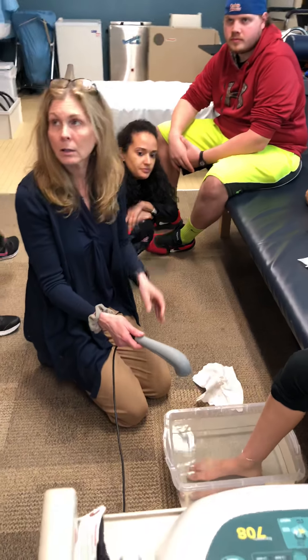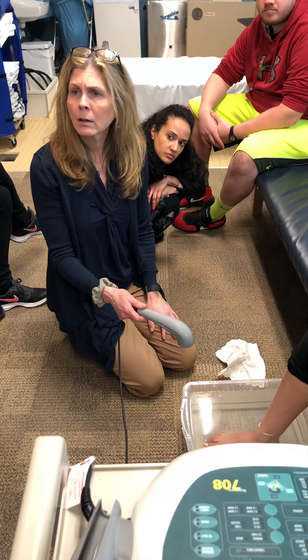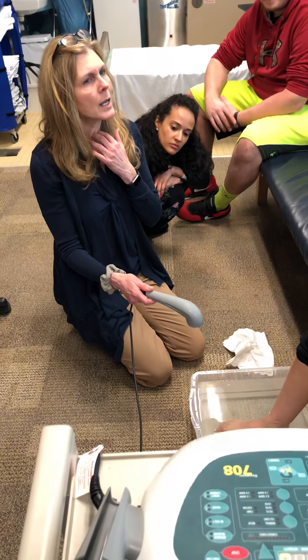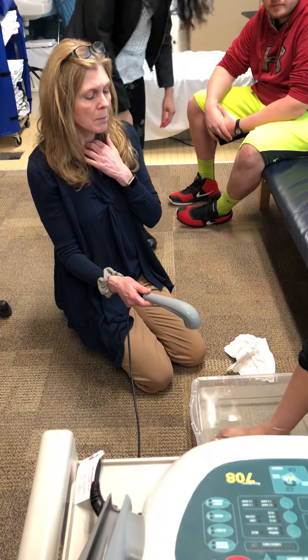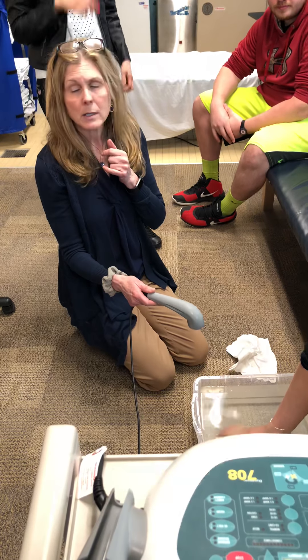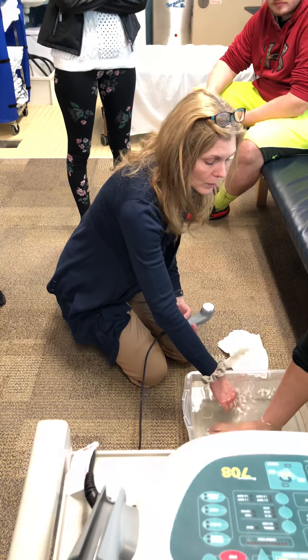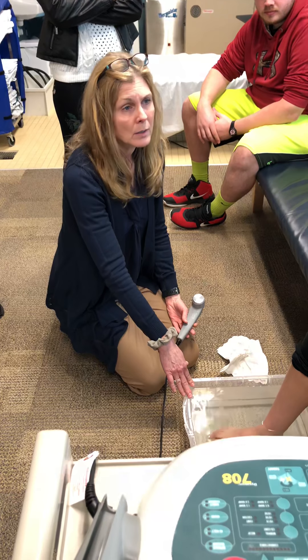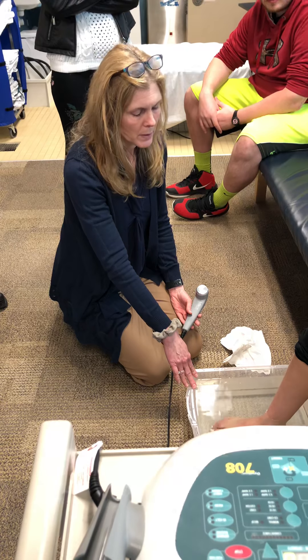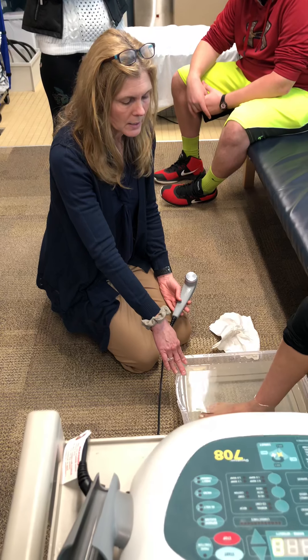Chiropractors use it too. They're not supposed to feel anything — nothing, or sometimes tingling. With the continuous setting, if it's chronic, do they still feel warmth? Sometimes not so much warmth because the water is warm. A lot of times they'll say it feels like a little tingling sensation, which is okay, but it shouldn't be painful. The water is warm — maybe around 102 degrees, not quite sure.